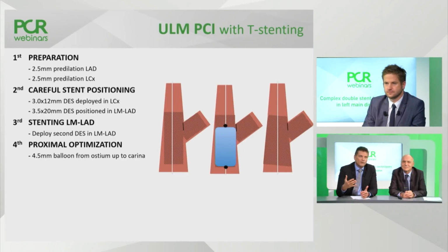And now how far can we go? In old times, this was limited because the stents had more restricted sizes. If we look at the modern stents, they can go up very high. Usually companies have 2 to 3 different sizes. So if you take, for example, a 3.5, it can usually go to 4.5, 5 plus. So it can usually go beyond 5, and you have no problem taking it up in the left main to these sizes. We have in the meanwhile questions from the audience.